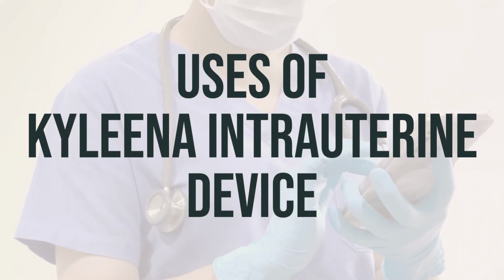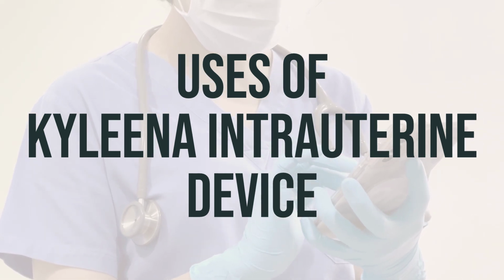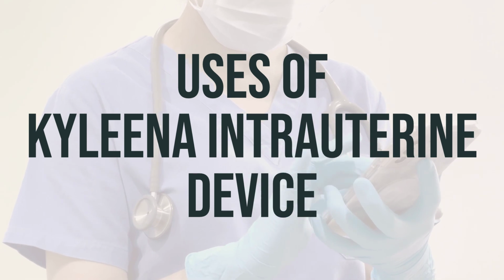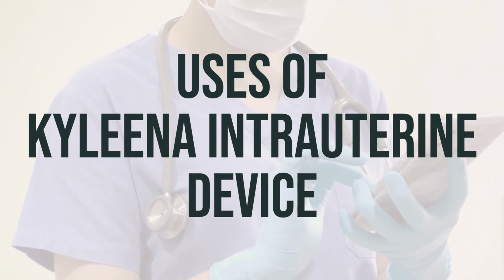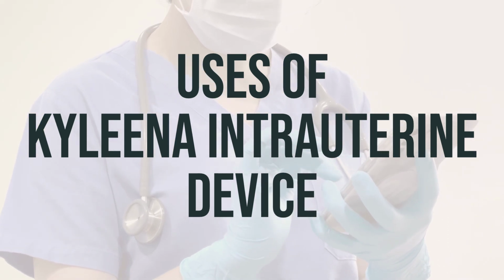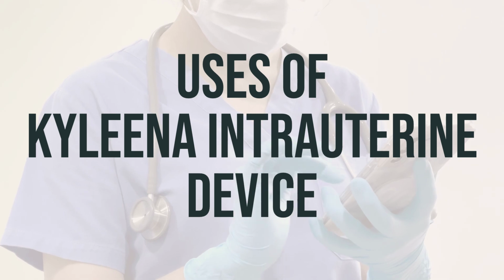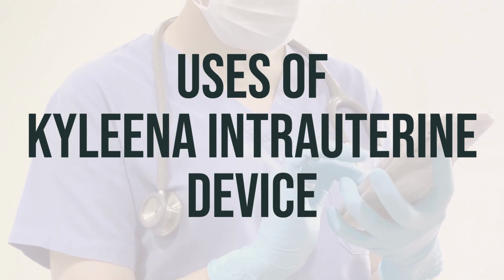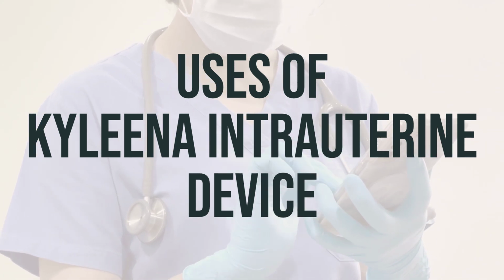The Kyleena Intrauterine Device is a small, flexible device that is placed in the womb to prevent pregnancy. It is used by women who want a reversible birth control method that works for a long time, up to 5 years. It is also used to treat heavy menstrual bleeding in women who choose to use this birth control method. The device slowly releases a hormone, levonorgestrel, that is similar to a hormone that women normally make. This device and hormone help prevent pregnancy.